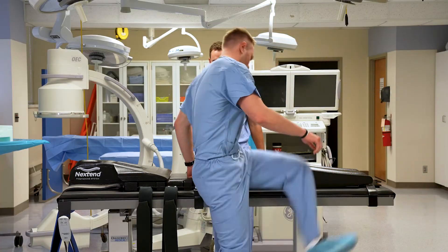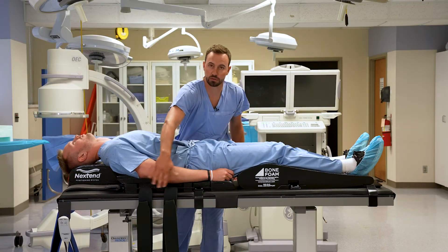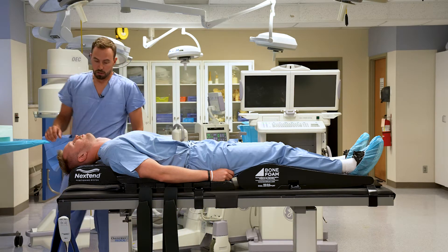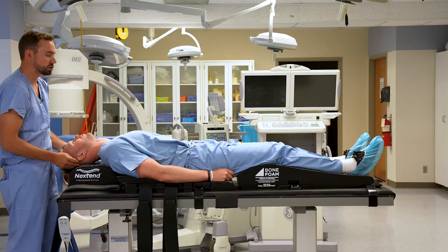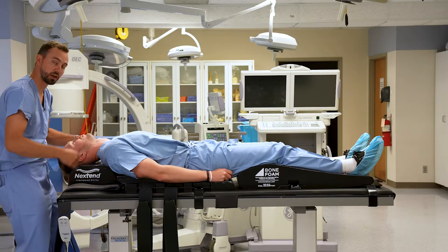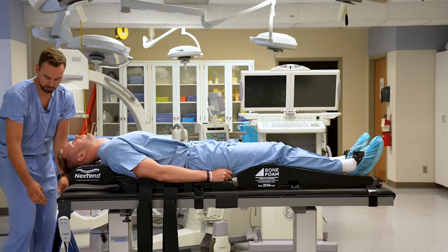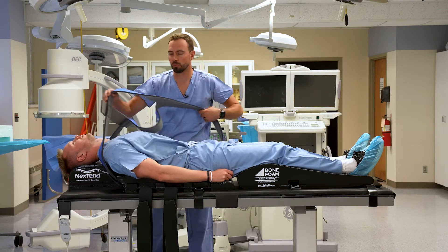This is Dawson — he's going to be our model today. Typically, when the patient is brought in on their bed, they'll be transferred over from the side opposite to where the straps are connected. When positioning the patient, we always start from the head down, because that determines where the leg positioner gets placed. We want the occipital aspect of Dawson's head to be right in the middle of this cutout. It's always good to err a little on the high side, because the relationship between where the straps are anchored and where they go over his shoulders is important.